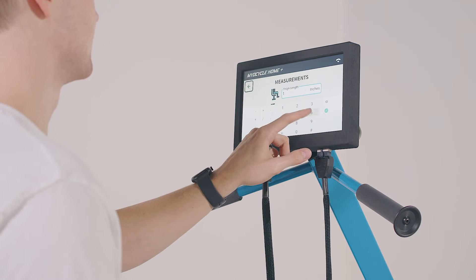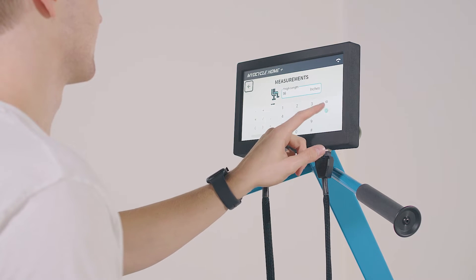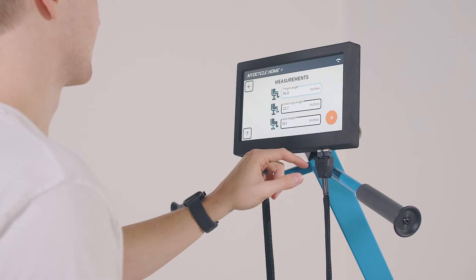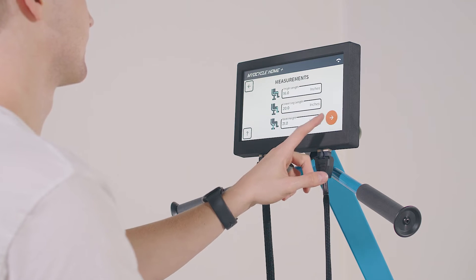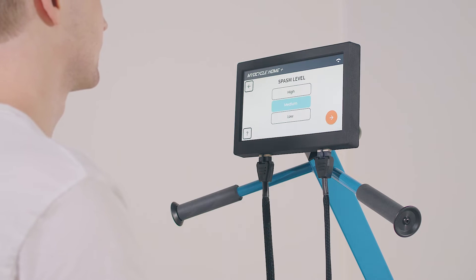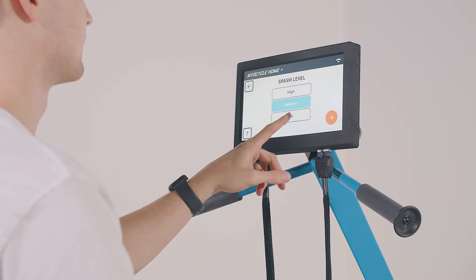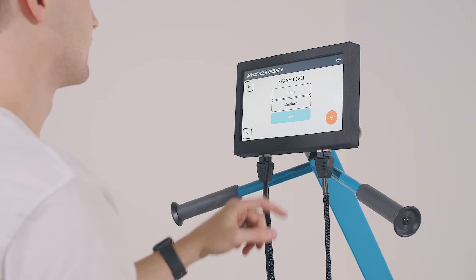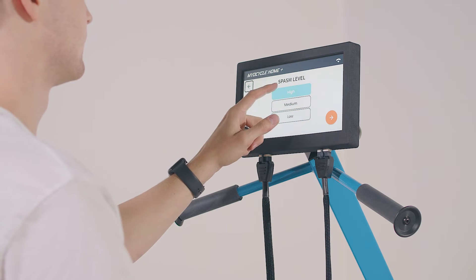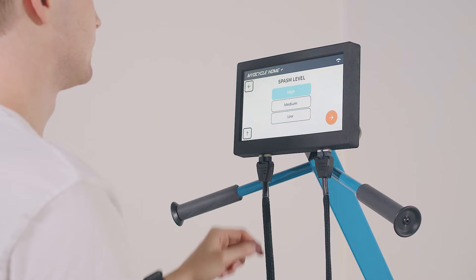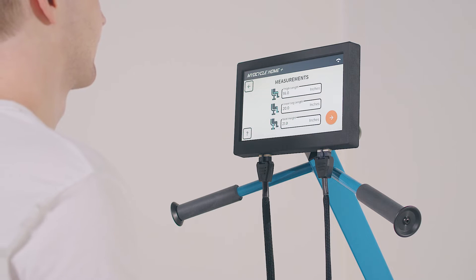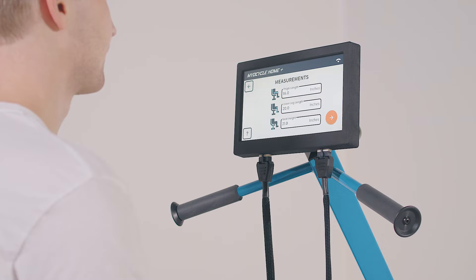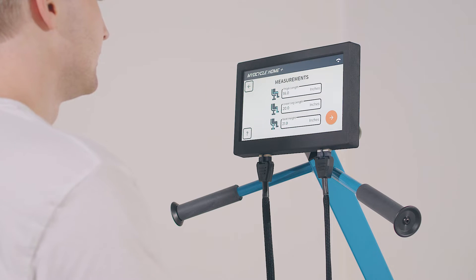Once you're logged in, you'll be prompted to enter the length of your legs and to select a spasm level. When choosing a spasm level, most adults use medium, but people with lighter, loose legs can use low and people with heavier, stiff legs can use high. Your leg measurements are used to customize the stimulation for you. For more details on how to properly take leg measurements, refer to the user guide.